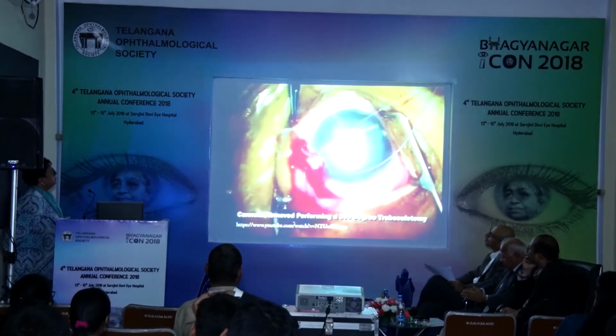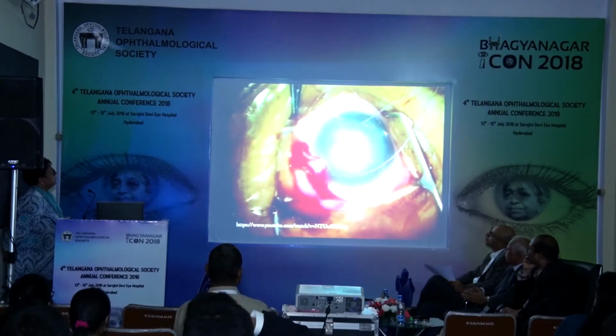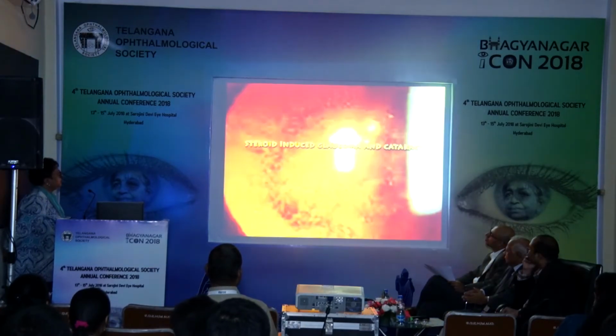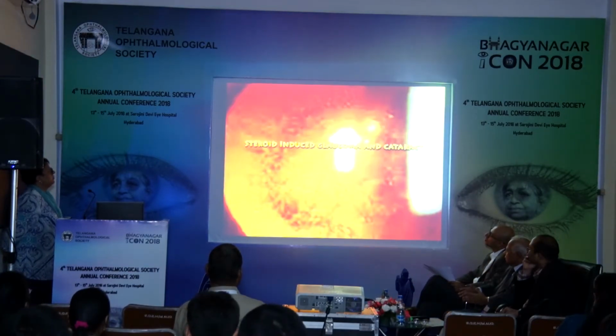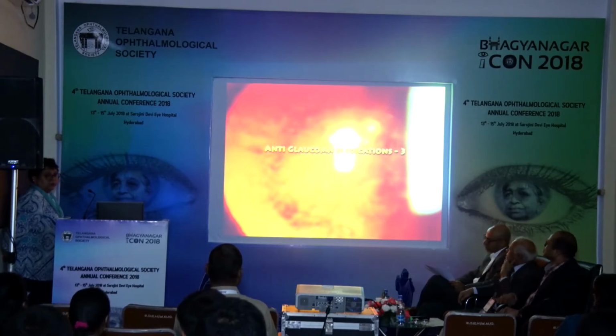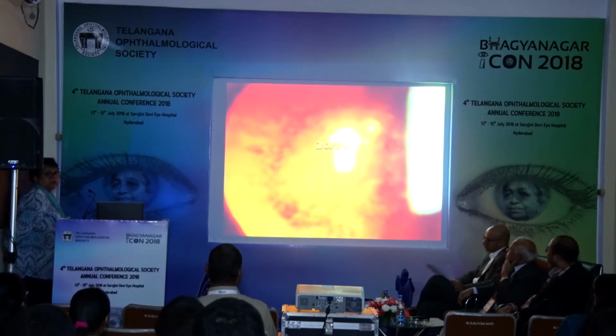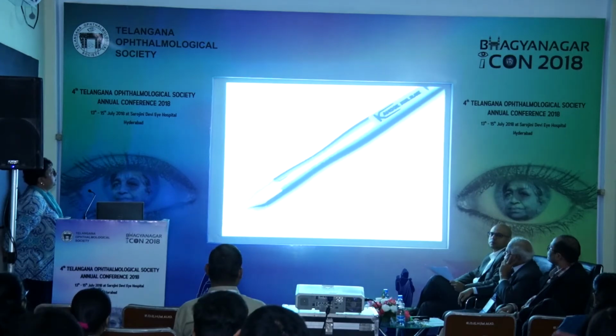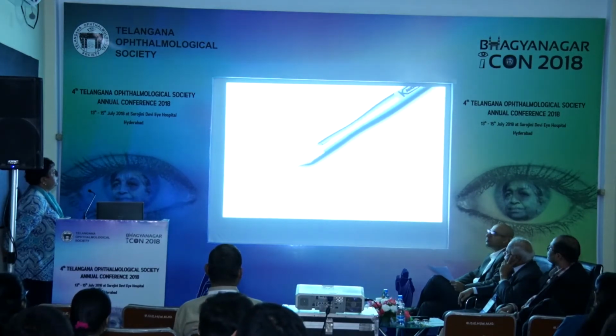However, not many surgeons have explored trabeculotomy as a surgery for glaucoma in adults. Our young adult patient had steroid-induced glaucoma and cataract. Glaucoma was just about controlled with 3 anti-glaucoma medications, and vision was reduced to 20/80. He was advised Kahook Dual Blade trabeculotomy with cataract extraction, to which he consented.